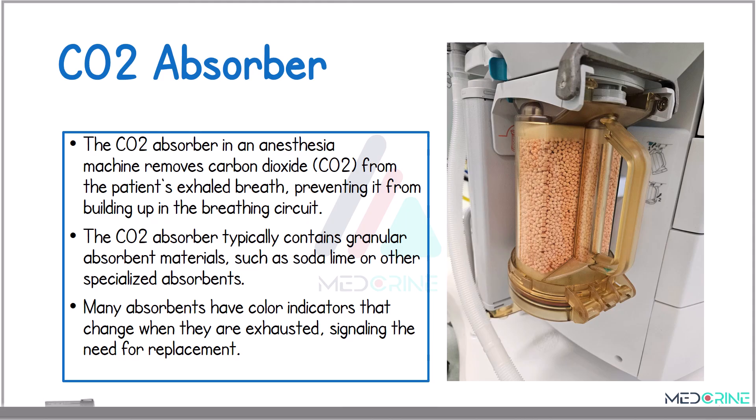A carbon dioxide absorber removes carbon dioxide from the patient's exhaled gases using materials such as soda lime. These absorbers typically include color indicators which change when the absorber is exhausted and needs replacement.